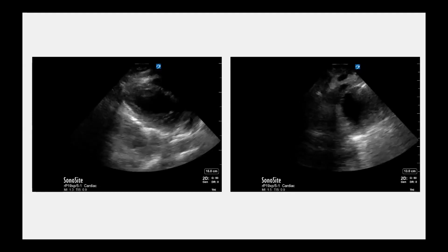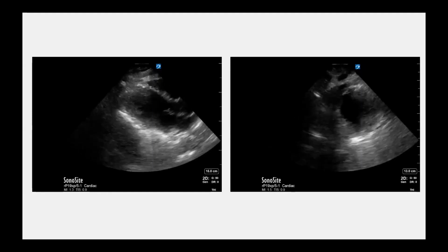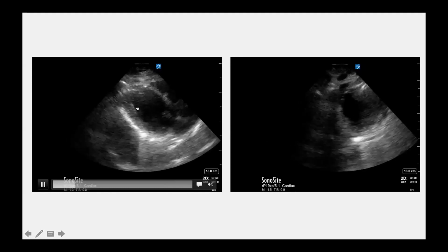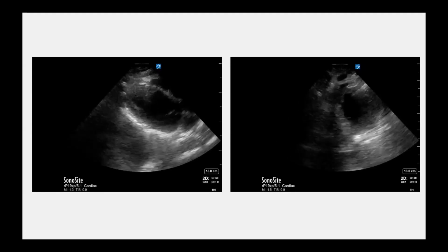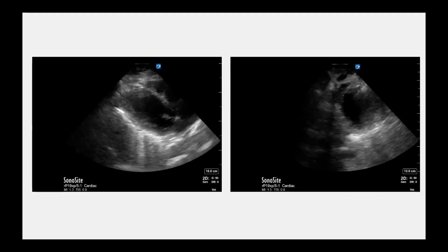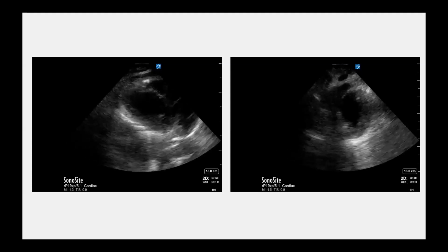Actually, it moves up fairly towards the IVS, not as much, but if you look at the LV, you can tell that the mid cavity area and the apical part of the left ventricle seem to be fairly dilated and may not have as much motion in the apical and mid portions. But if you look at the basal segment of the LV, where the mitral valve is, overall excursion seems to be fairly okay. So it's definitely over 40 percent, in terms of the 40, 45.